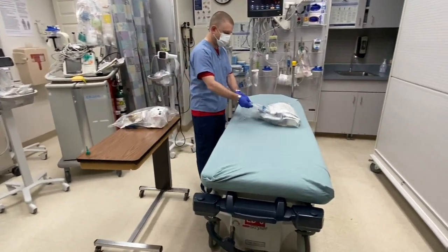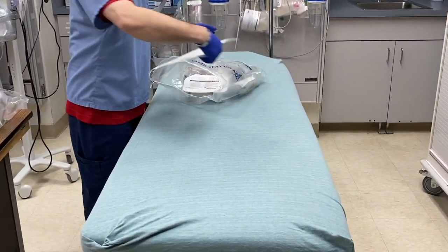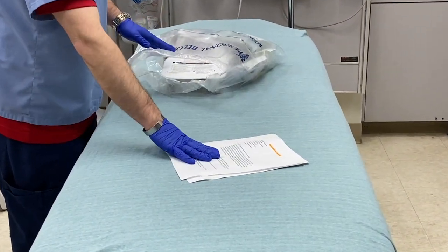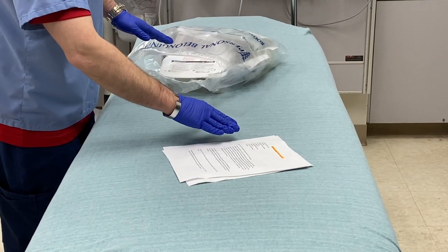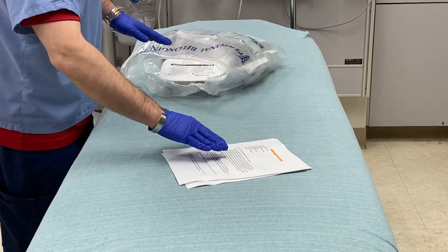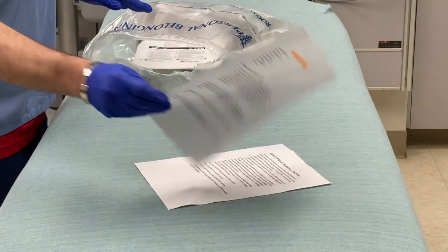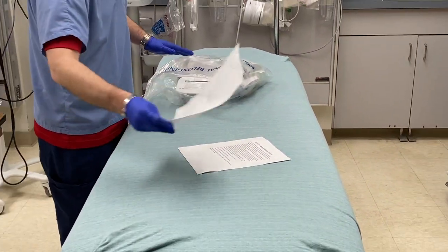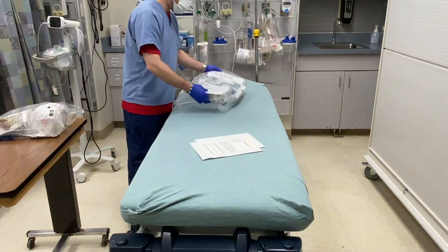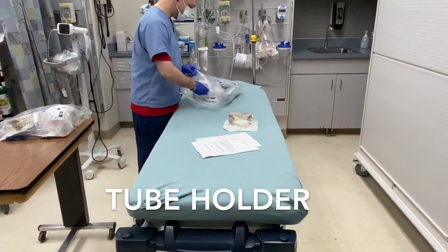These are the packs that were put together by one of our nurses. In the pack, we have a checklist for what's supposed to be in the pack, and then it gives you an overview of how we're doing this. Then it gives you an intubation checklist, and that's going to be part two of our video series. So in the pack, you have a tube holder.